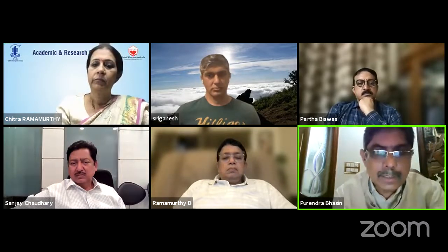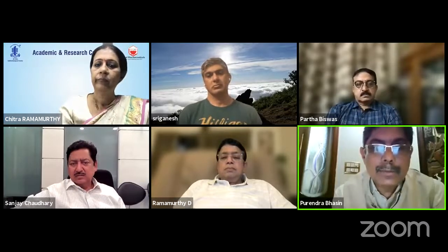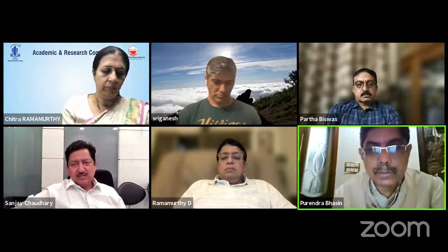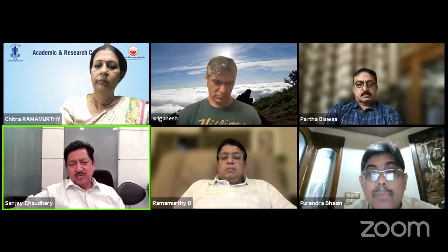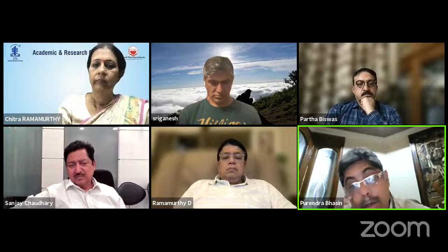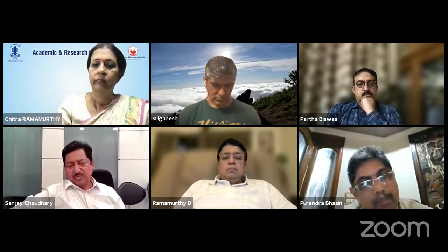One question with Dr. Sanjay. Have we done the UBM in this particular case to see the sulcus, if there is anything there? Like Dr. Rajesh was also saying, if there is a chance of an iris cyst or anything like that in the sulcus. We don't have a UBM. That could be one possibility, or maybe the haptic is rubbing, or maybe tilt of the ICL or IPCL, whatever it was, which was in one direction. Was the vault uniform all over? Yeah, it was absolutely uniform.